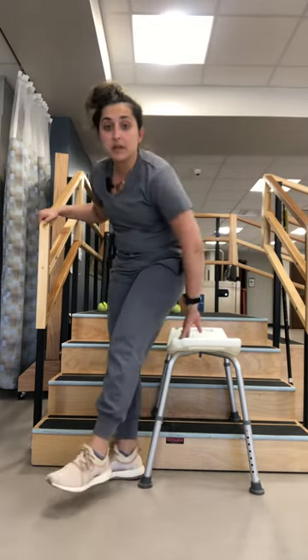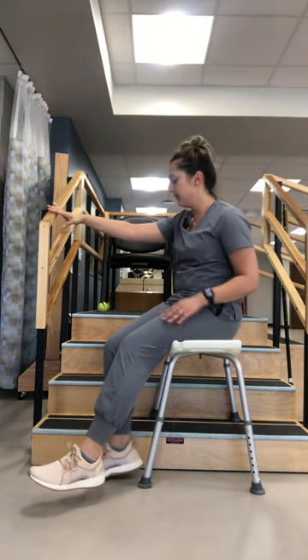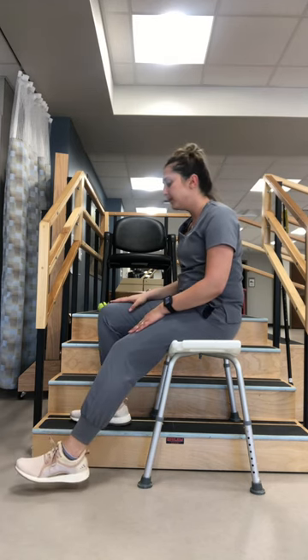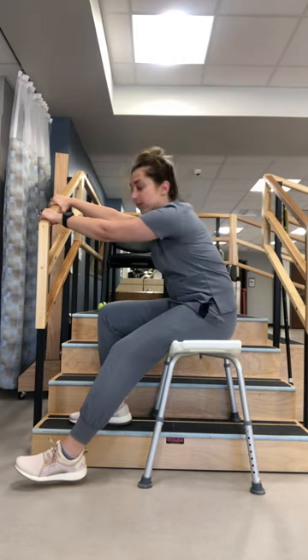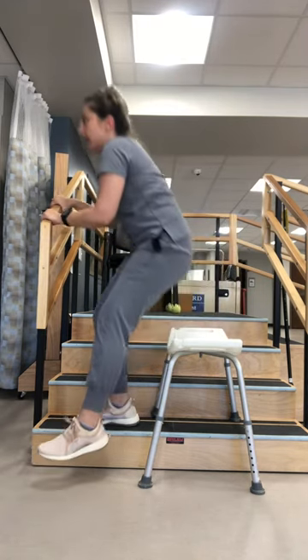You're going to have the patient sit down on that seat. Say that my left leg is affected — I'm going to put my right leg, my unaffected leg, down on the step. My weight's going to go down through my good leg. Both of my hands are going to go on the rail.